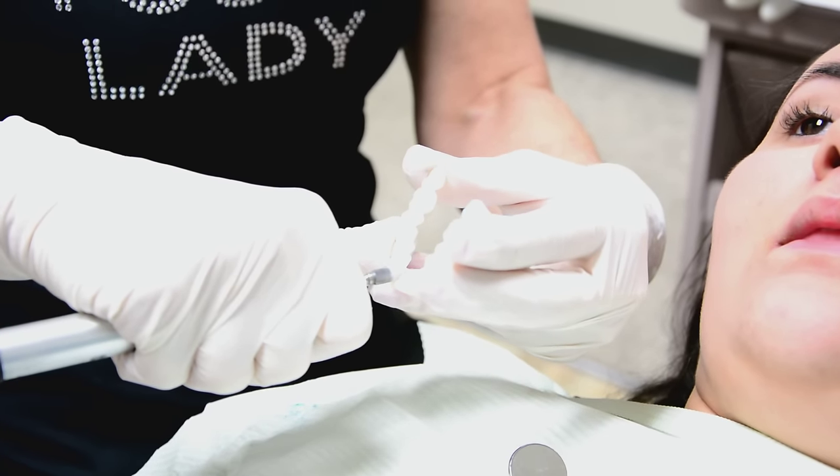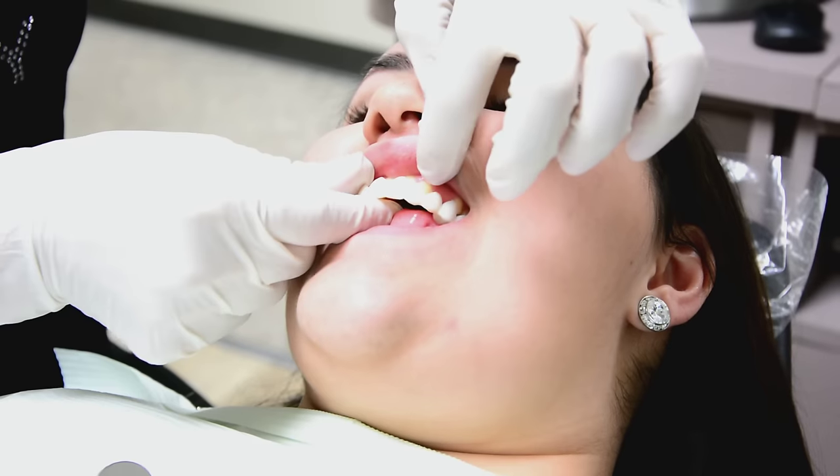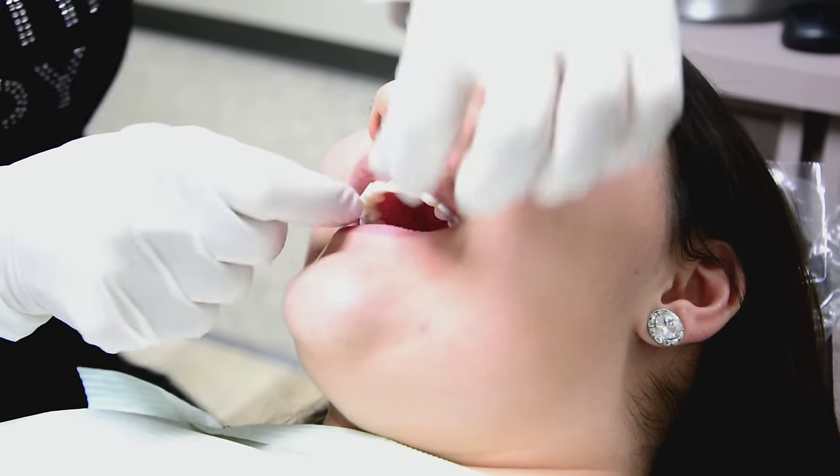Then you go back and polish. We try it again to see if there's improvement — say 'church,' say '66.' That sounds better. We ask: do you want a little bit more removed? Yes. Just ask the patient and they'll let you know.